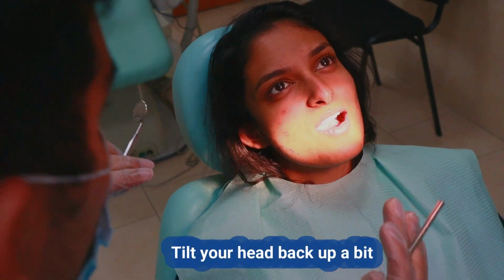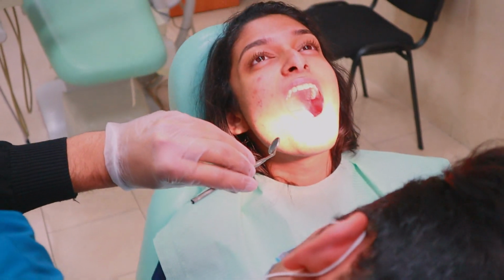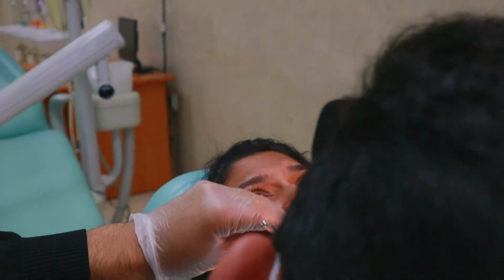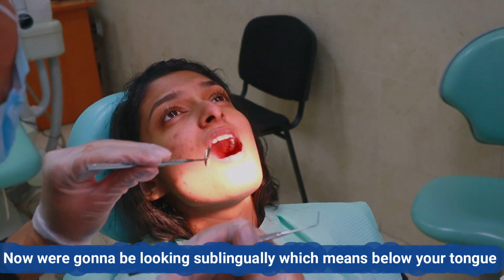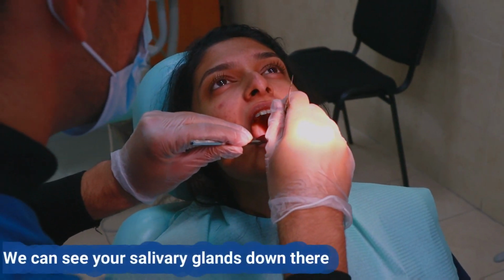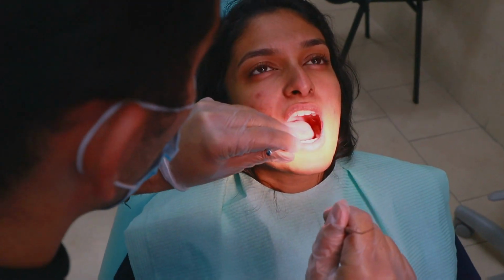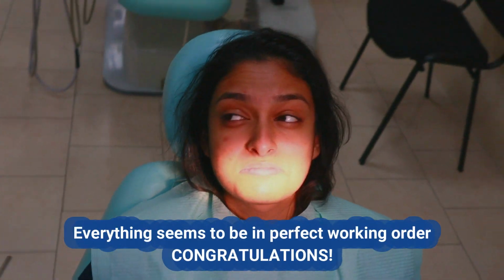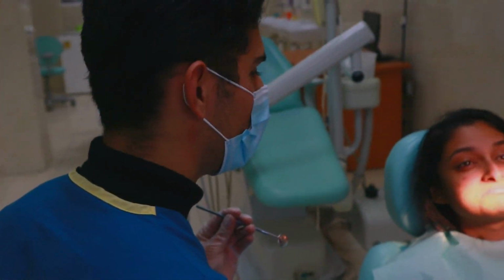Turn your head backwards. Now we examine the hard and the soft palate and below the tongue, or sublingually. Now we're going to be looking sublingually, which means below your tongue. You can see your salivary glands right there. And face down a bit. There you go. Everything seems to be in perfect working order. Congratulations. Your mucosa has no problem, so we can move on to the next.